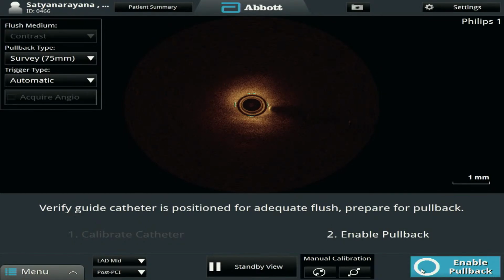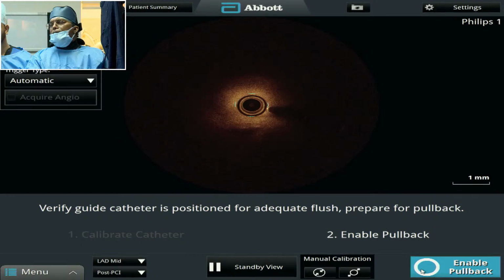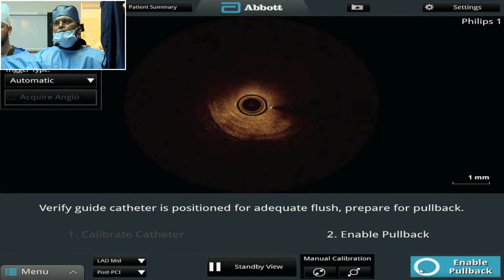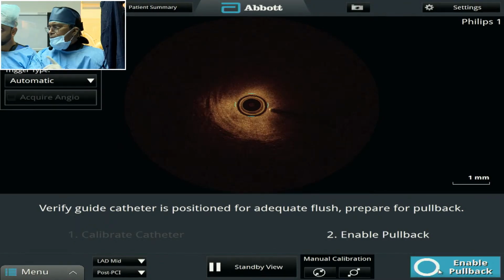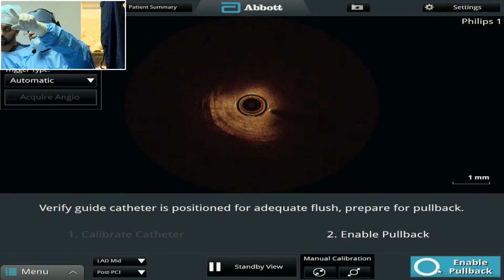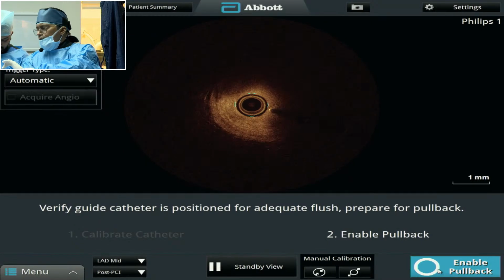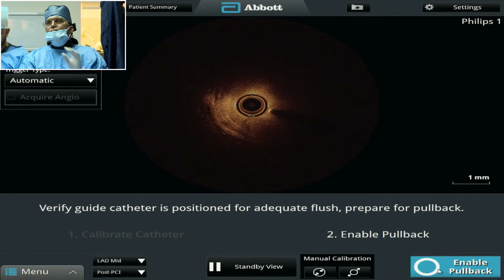Now inject. Now this is fine. But I think we understand that. If you want to slightly, you can push it. That's enough. That's enough. Now, consistent force until that marker is there, no? It should move into the catheter. Until then, you apply the pressure, but at the same time, maintain the last 1 to 2 ml inside the syringe.